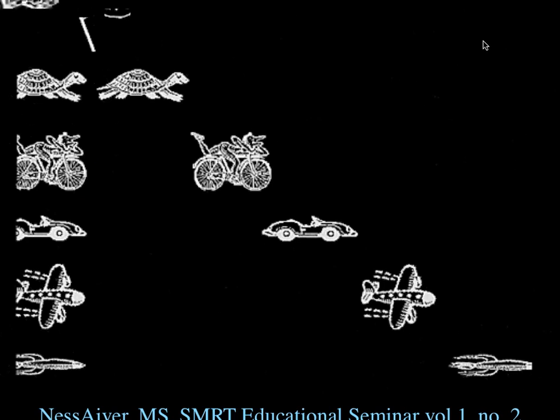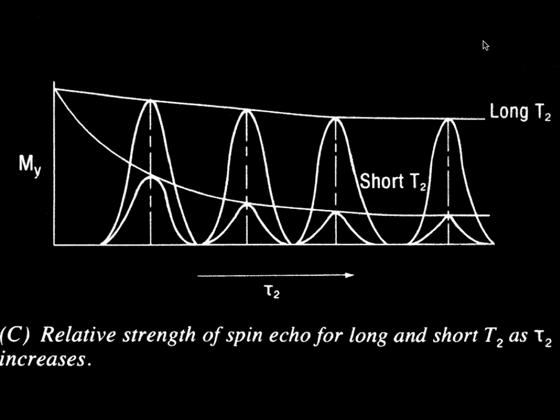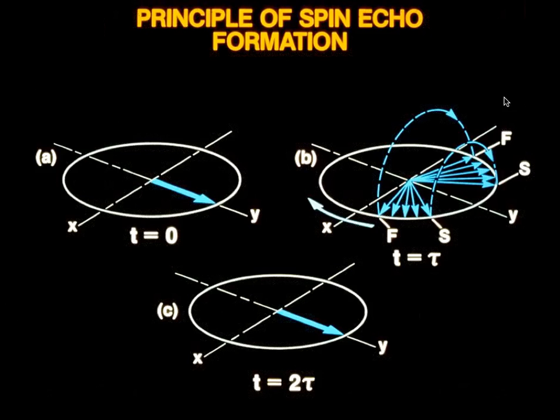Michael? I think that you lose signal anytime. You have maximal signal just after your 90-degree pulse, and then anytime after that, you start to lose signal. But remember, if the fast guy stays fast and the slow guy stays slow throughout the whole process, then they'll come back and be exactly in phase, and we'll get the full signal.